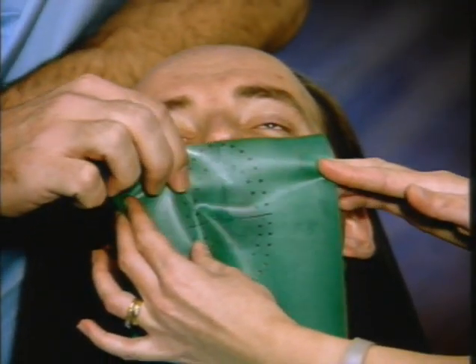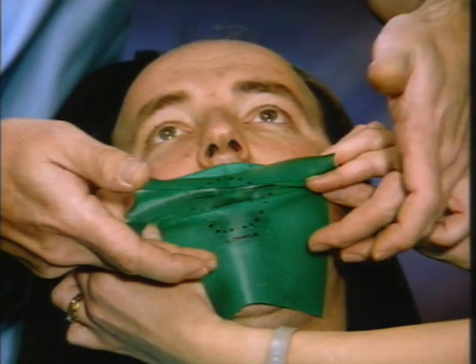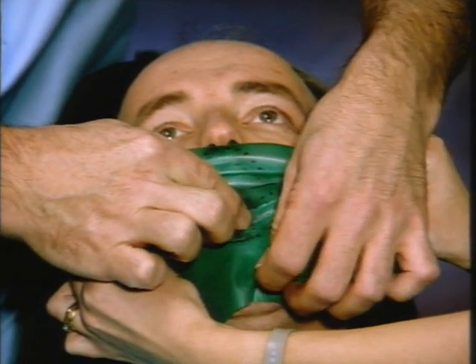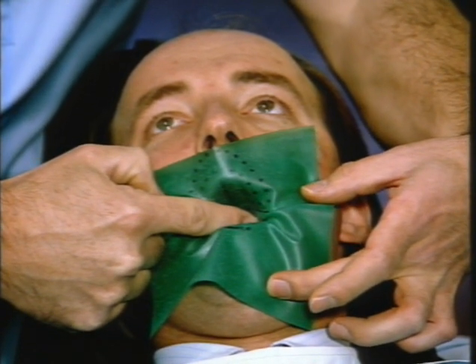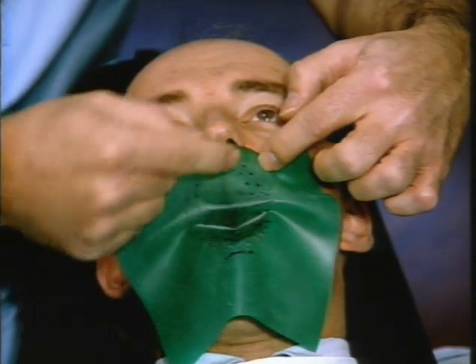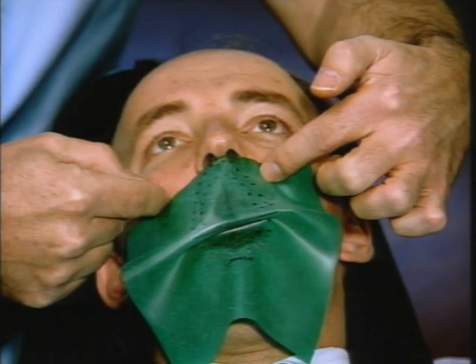Similarly, if you're working on a lower incisor position, then so that the nose isn't covered, if you displace the stamp to the upper edge of the dam, then by the time this is in position on the mouth and held firmly back, then obviously you can see that the nose apertures aren't covered. Should there be any inadvertent covering of the nose at this point, then it's simple to take a pair of blunt nose scissors and just cut away from in front of these apertures.